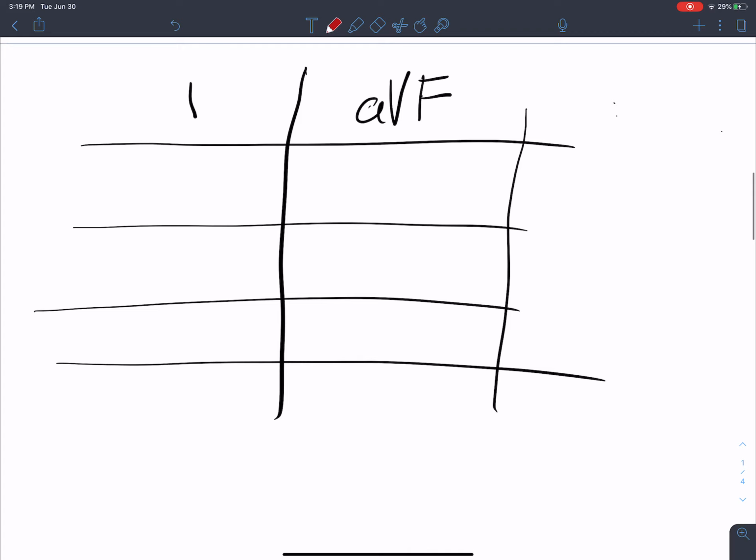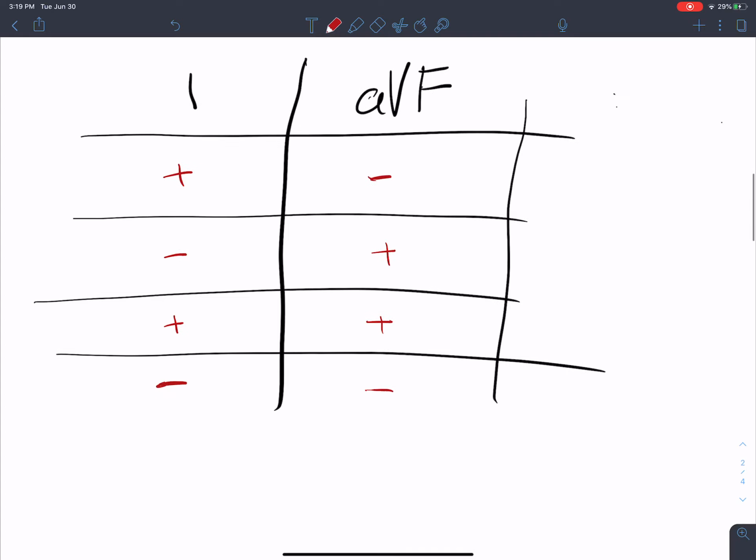Great. Moving on. We're just going to put some stuff here. We'll go positive, positive, negative, negative, positive here, positive there, negative there. No duplicates, right? Perfect. Now, all we're going to be doing here is looking at these two things, this graph, and trying to figure out, based on these plus and minus signs, what direction the axis is going in.